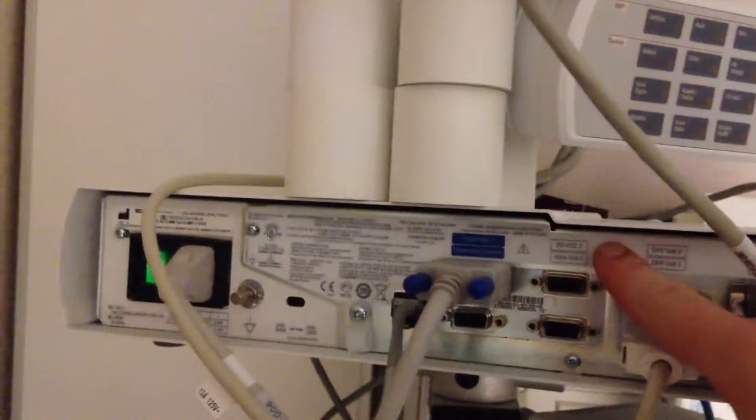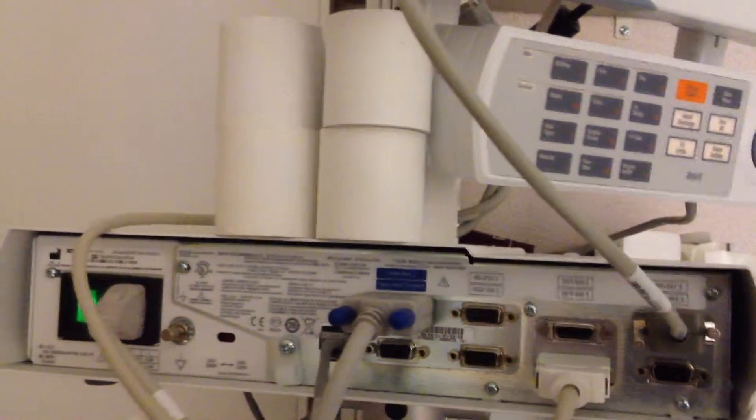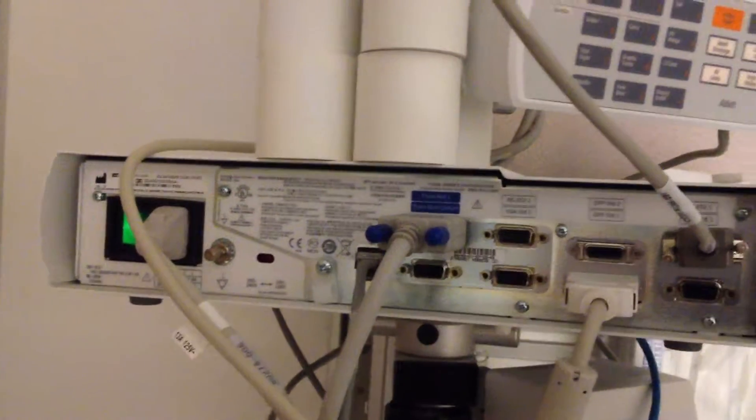You also have the RS232-2 port on this side — you can connect into there as well. The top port on this side is the TramNet-1, and then down below we have the TramNet-2.